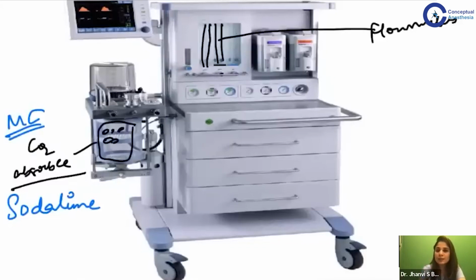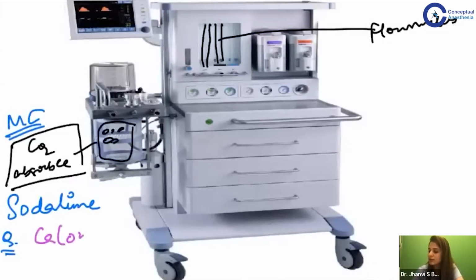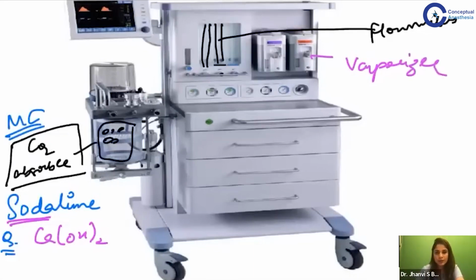The second question that comes about a carbon dioxide absorber is, what is the main component of carbon dioxide absorber? The main component of carbon dioxide absorber is calcium hydroxide. Okay, many of you will see soda lime and answer sodium hydroxide, but no, the main component of carbon dioxide absorber is calcium hydroxide. So these are the important things that you need to know about the machine. From the front, you should be able to identify the vaporizer, the flow meter, and the carbon dioxide absorber. At the back of the machine, we will have cylinders. We will discuss the cylinders and the pipelines and their color coding ahead.